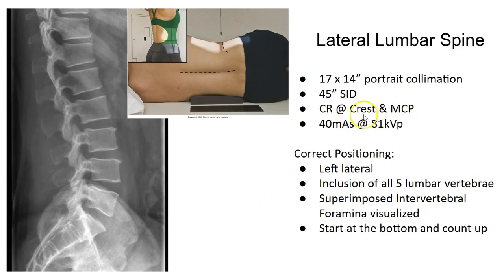Again, your text recommends crest and mid-coronal plane. I still go a couple fingers above crest. I like L3 a little bit. I just think, again, it centers our anatomy better on our image receptor. And this time we're going to use a little more technique because we're really penetrating through a thick body part. So 40 at 81 approximately.